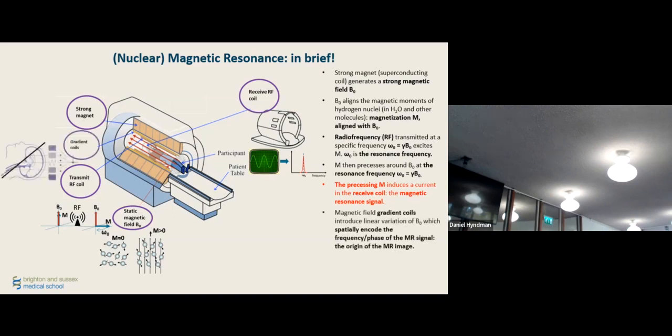We will also, at some point, talk about magnetic field gradients. In imaging, the gradients are extremely important. These are those that encode the frequency along the axis and allow us to generate an image. Here, in the context of MRS, we will see where it comes. It comes, of course, when we talk about the localization of the signal where we want it to be measured.